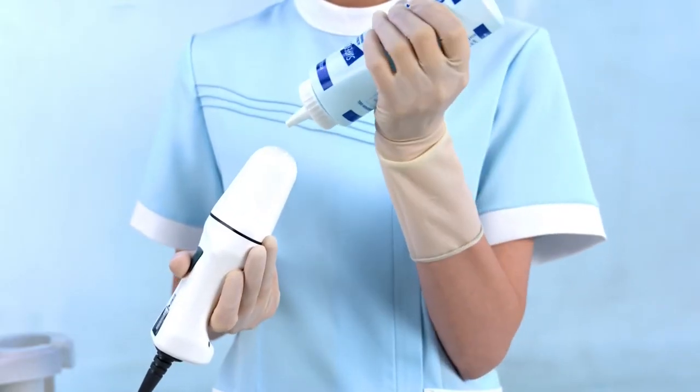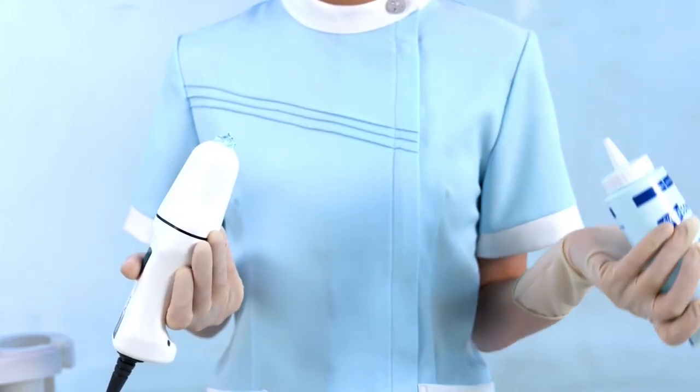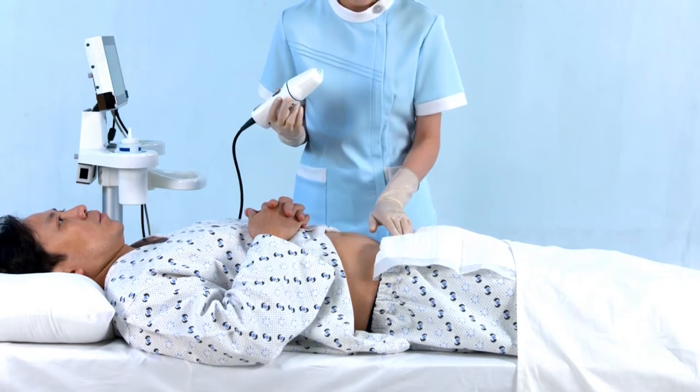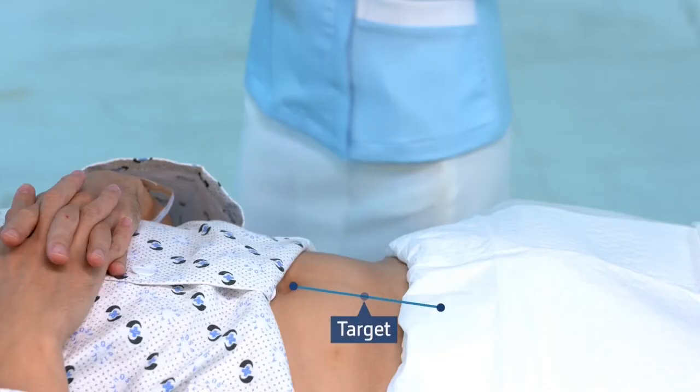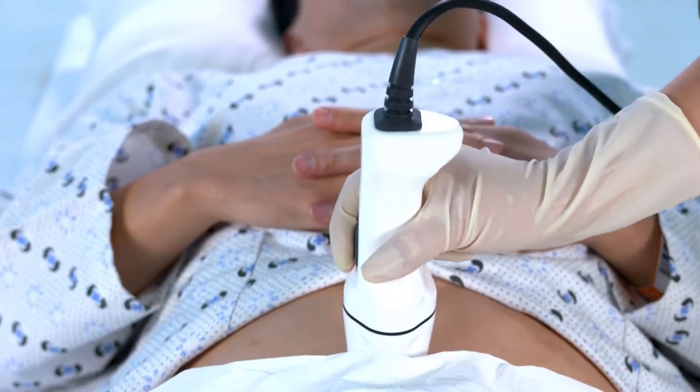Apply the gel on the probe head. Palpate the pubic bone. Draw an imaginary line that extends from the navel to the pubic bone, and place the probe on the patient's abdomen three to five centimeters above the top of the pubic bone. Hold the probe following the body diagram on the top of it.